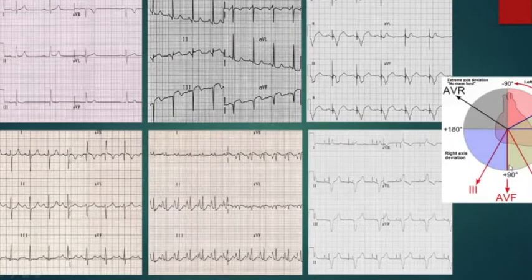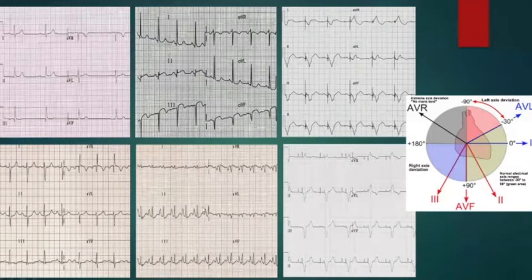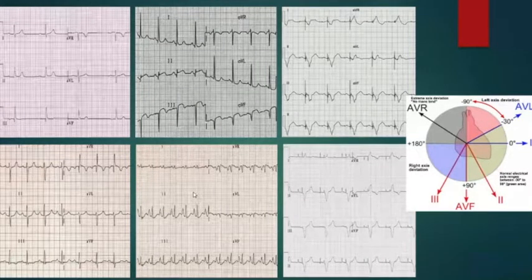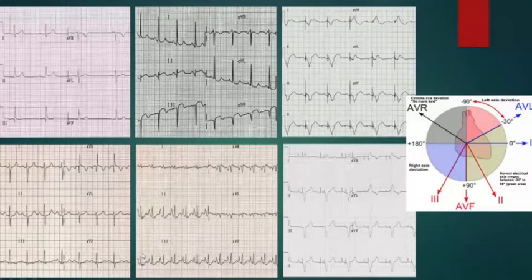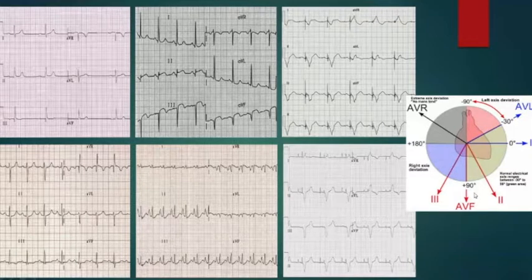This is the most difficult case to define. Every situation has to be ruled out, so this is something to confirm the rule. Don't bother with that. Sometimes you have to guess between some intervals. Sometimes it's impossible to define the axis.